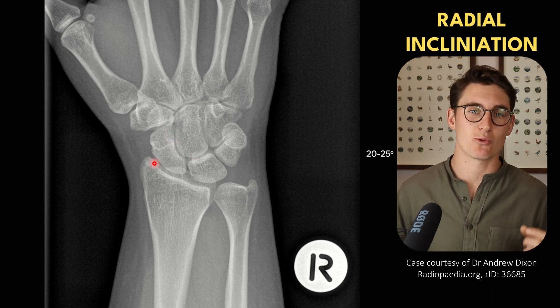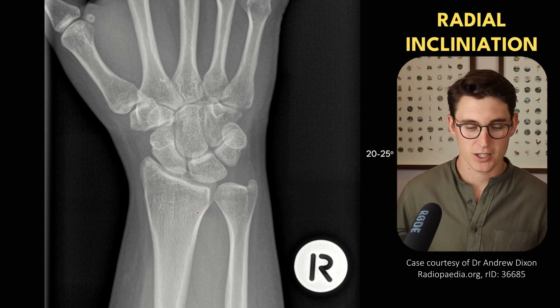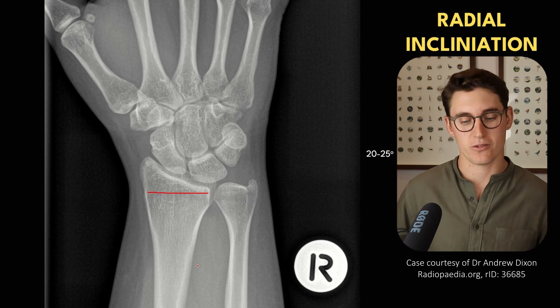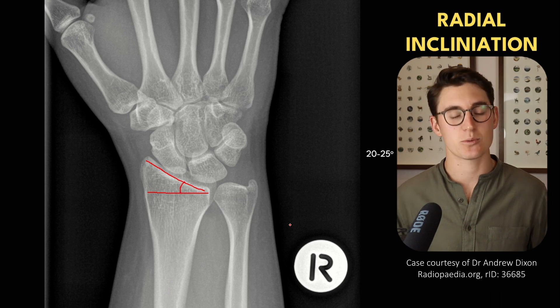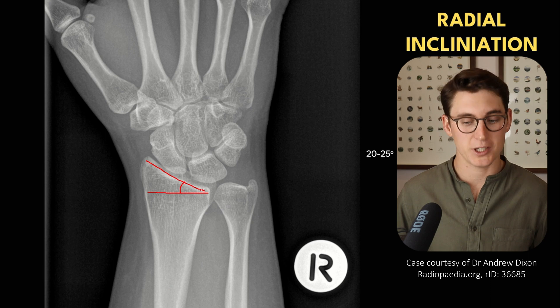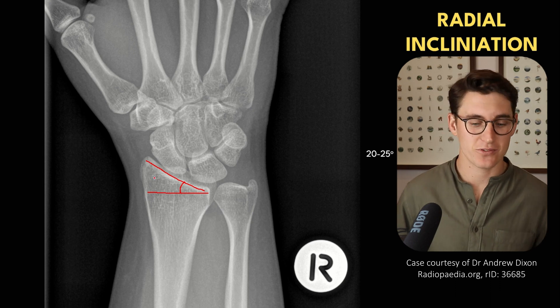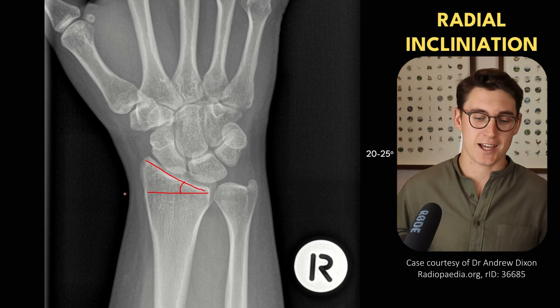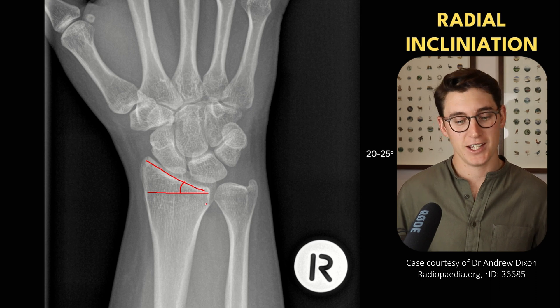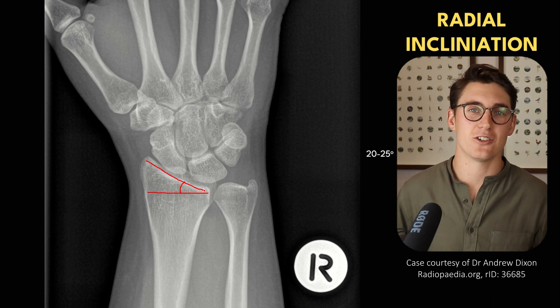Next we can look at what's known as radial inclination. If we take our radius and draw a perpendicular line to the shaft, we can then draw a line along the articular surface and measure this angle — that's the radial inclination angle. That angle should be between 20 and 25 degrees. If we're dealing with less than 15 degrees, we should really suspect some form of distal radial fracture where we've lost that angle. If the angle is more than 25 degrees, we could be dealing with a deformity known as Madelung's deformity.